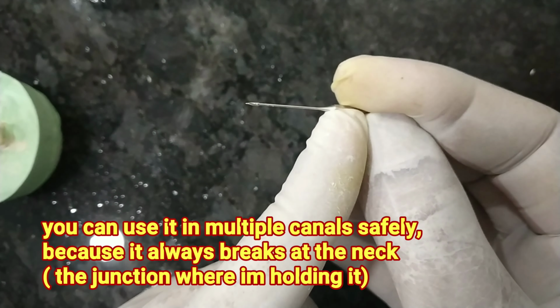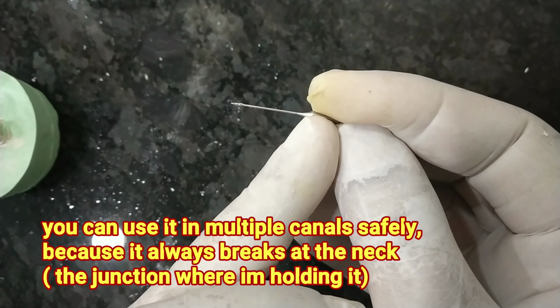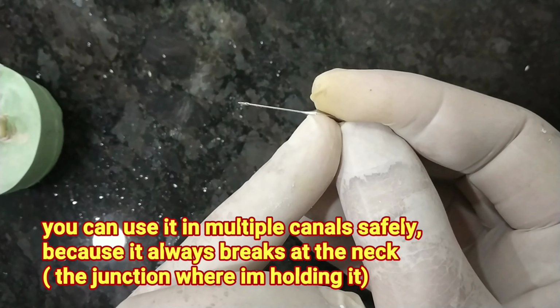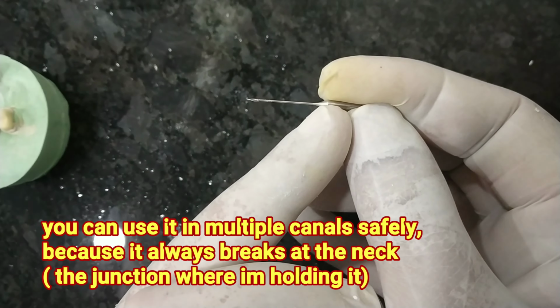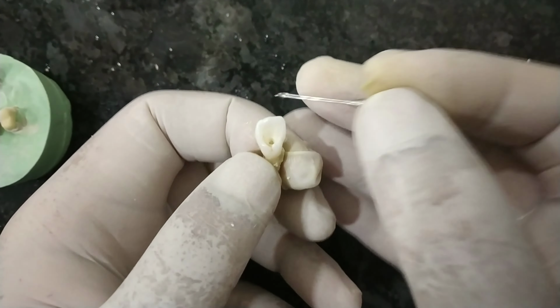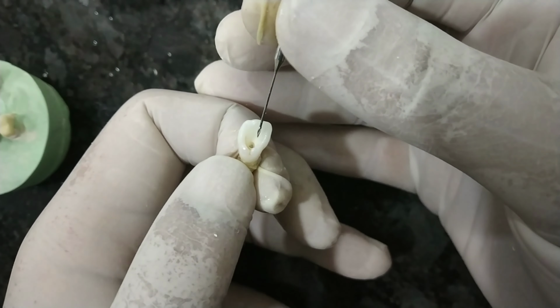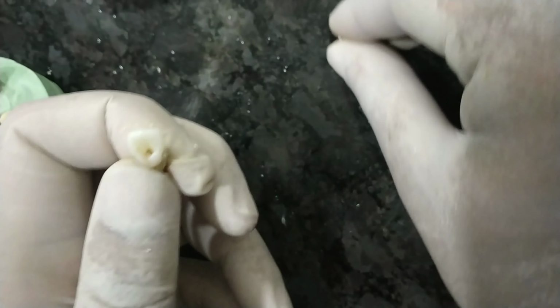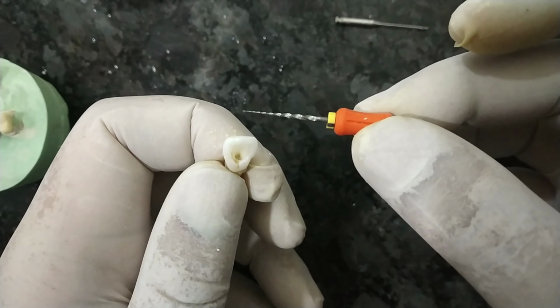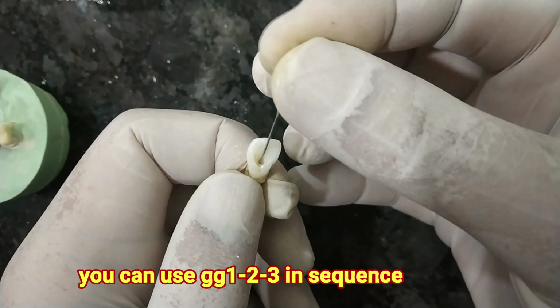If the drill binds during use, it will fracture at the neck of the shaft and will extrude from the tooth. The fractured segment is easily removed by grasping the broken shaft with pliers and pulling it out of the tooth. It is mainly used to remove the lingual shoulder during access preparation of anterior teeth and to enlarge the root canal orifices. In place of using the SX file, you can also use the Gates 2 and Gates 3.